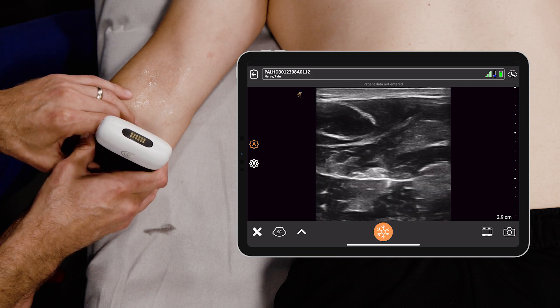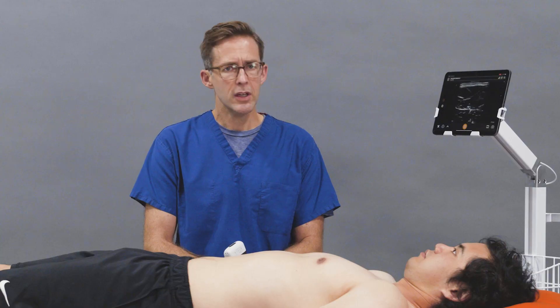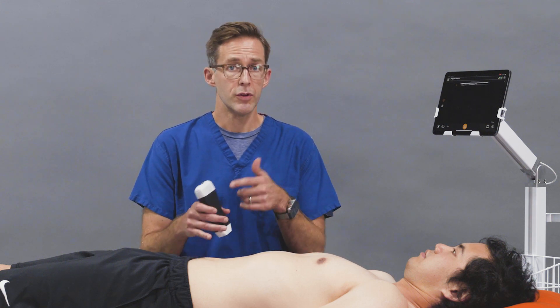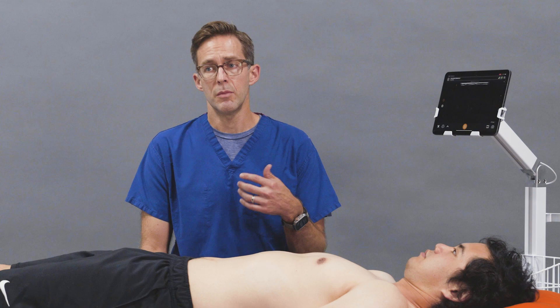So that's the median nerve block. You can do a median nerve block blind, but with an ultrasound, it improves your accuracy and it minimizes your complications.